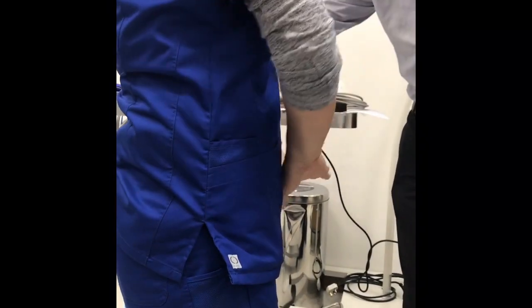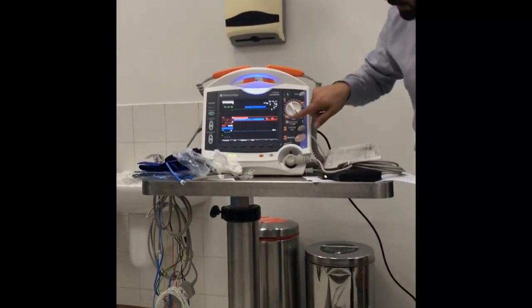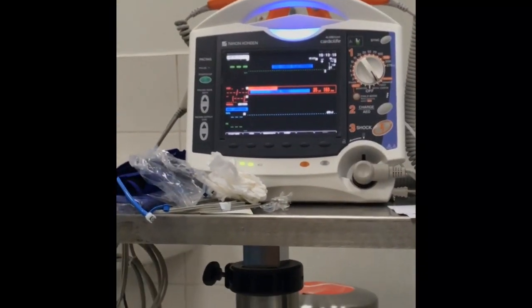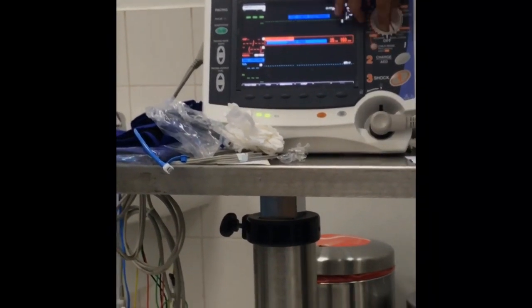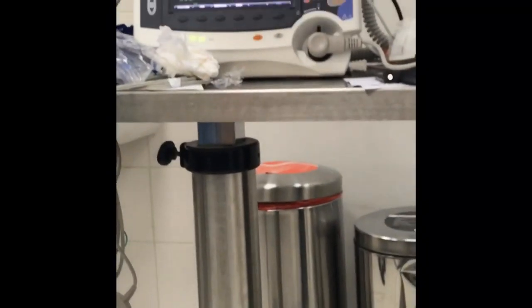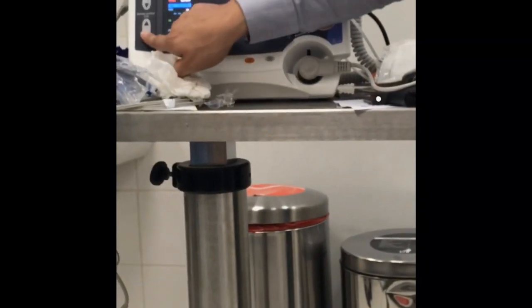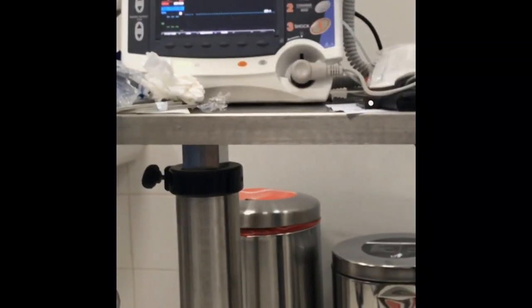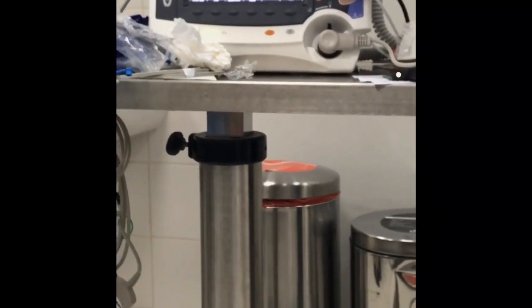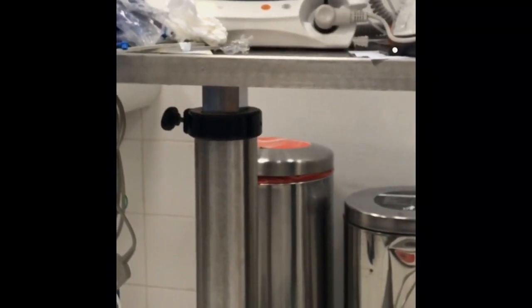If I assign the pacing value 90, for example, or 80, and I assign 40 milliampere, then if the value is less than 80 beats per minute or pulse per minute, the machine will start giving current. This is through the pads. We have to use the AED pads, which can be used for AED mode and pacing mode.